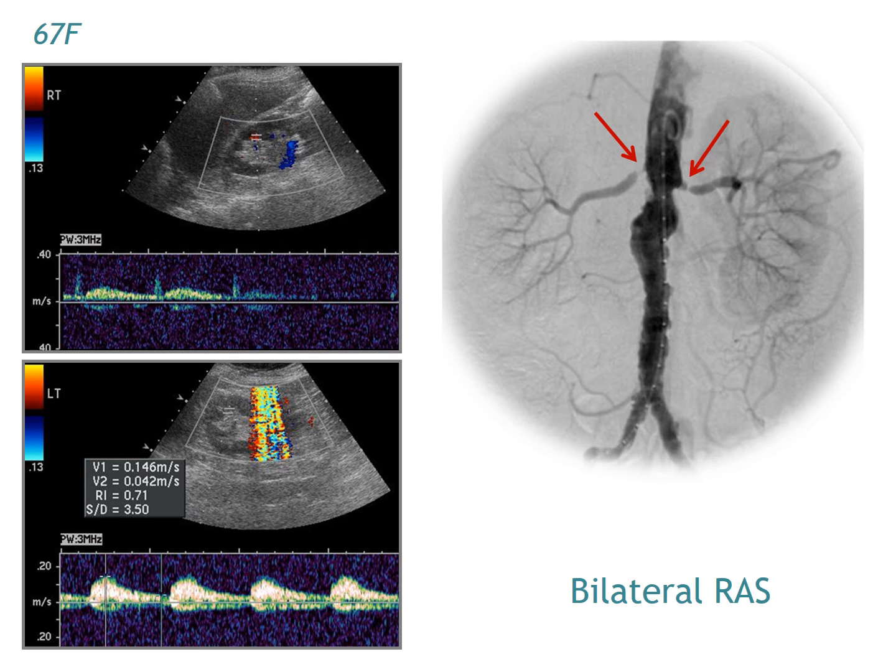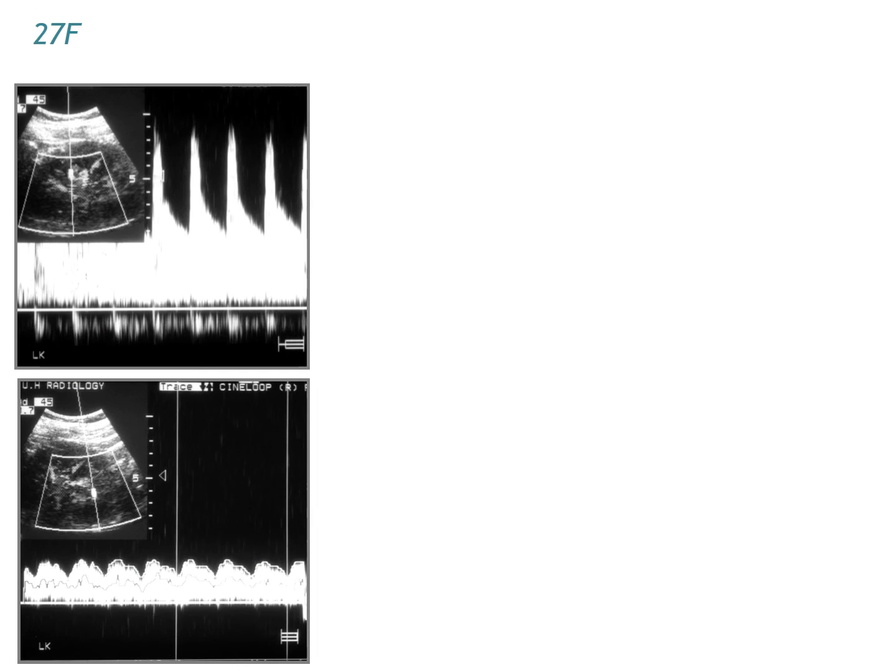Another patient with bilateral renal artery stenosis, probably caused by atherosclerosis in an old woman. Doppler on the left side looks better than the right side, but also has a stenotic lesion at angiography. This is a young woman, and the Doppler spectra from the interpolar area of the left kidney look normal, but those from the lower polar area look abnormally slow and weak.